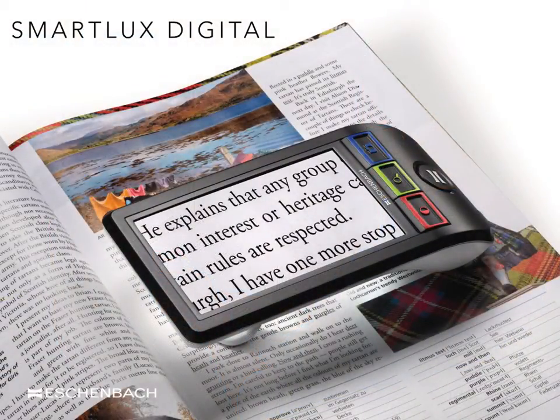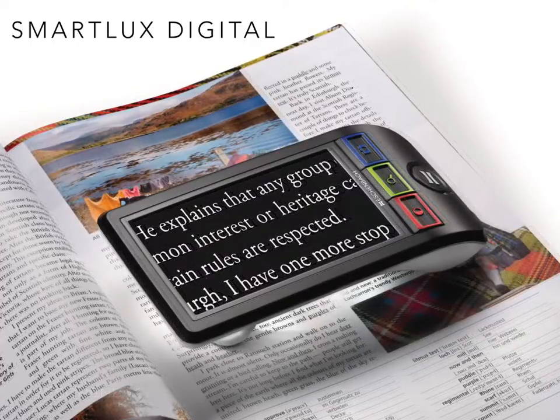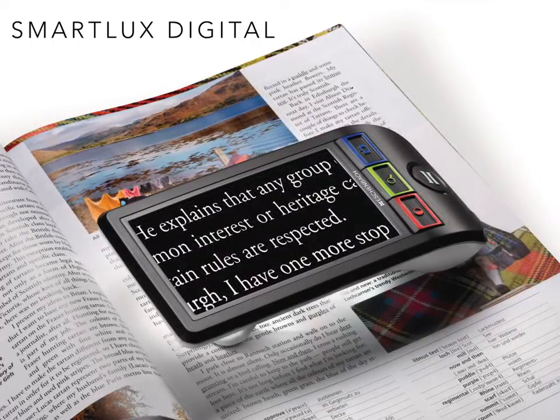One of the main advantages of digital magnifiers is that poor or low contrast print may be digitally enhanced and reproduced in a higher level of contrast — that is, made more black and white. Most significant of all is the benefit of reversing the contrast altogether, seen here in the picture. A large number of visually impaired users benefit from this reverse contrast mode. With the black background, there is a reduction in excess reflected light entering the eye, reducing glare and improving the eye's overall retinal sensitivity to the object or print in view.